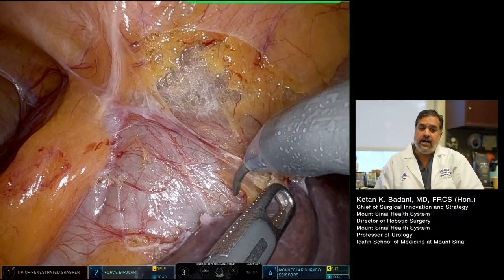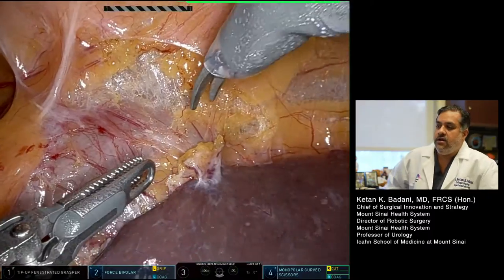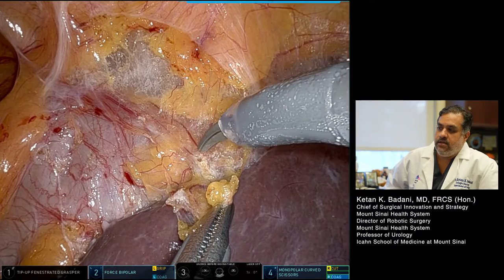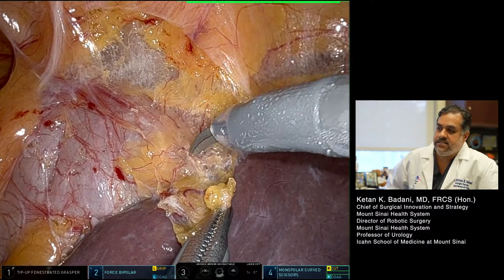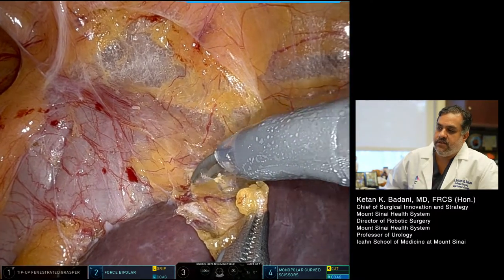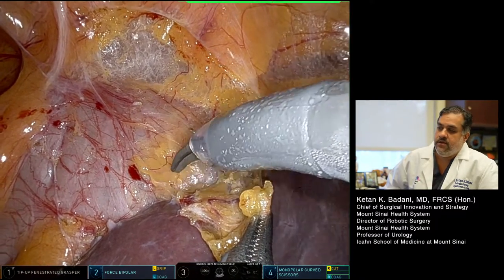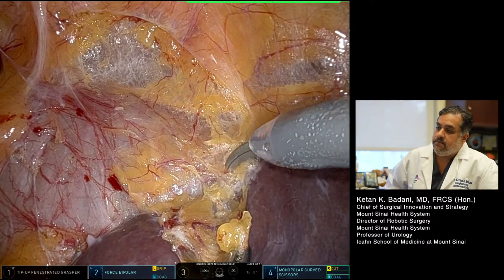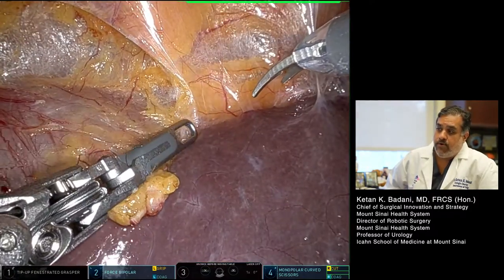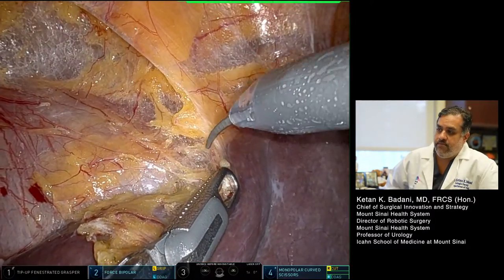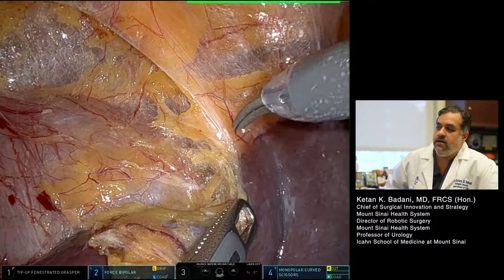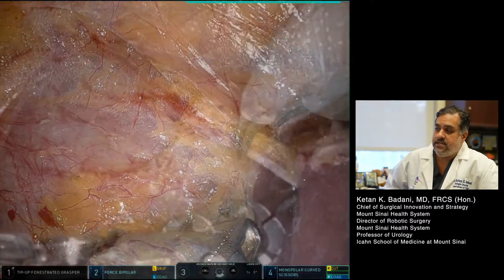If you take your time, you can always release the liver off the retroperitoneal surface. My guess is this operation was done in another country, so I don't have access to the details of the first operation, but my guess is that this was an anterior tumor given the density of the adhesions as we get closer to the kidney. Carefully releasing these adhesions is an important part of redo surgery and any partial nephrectomy on the right side. Many times it's hard to predict adhesions from a cholecystectomy or any other surgery, even hepatitis.